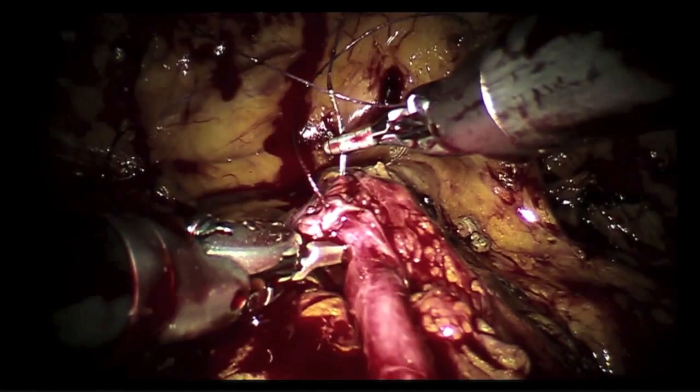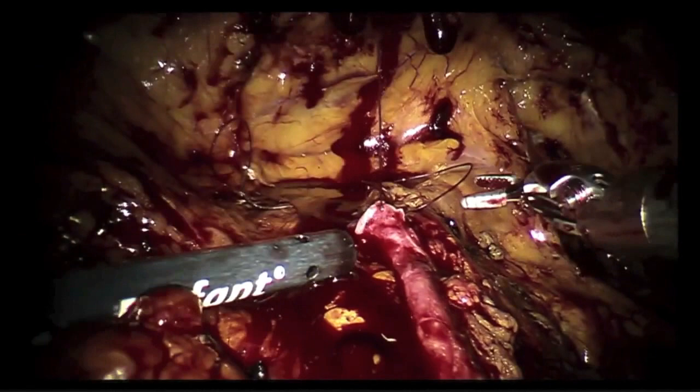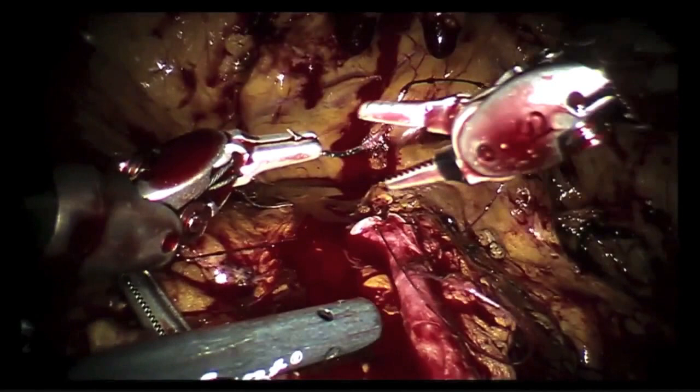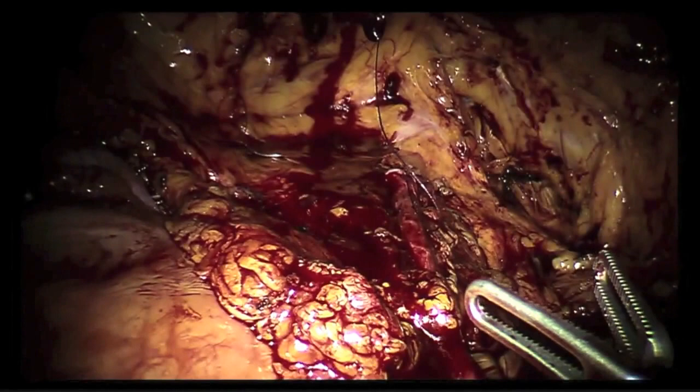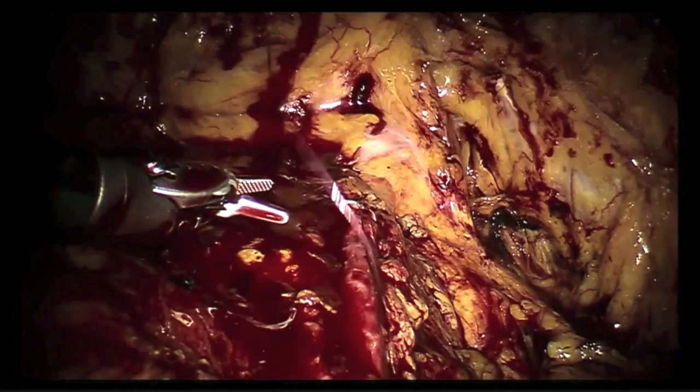So as you can see, in the entire vascular anastomosis of two vessels, and in the anastomosis of the ureter, not one time was the mucosa grabbed. Not one time was the endothelium grabbed. Not once. I mean, that's what surgery is about. Would you agree?